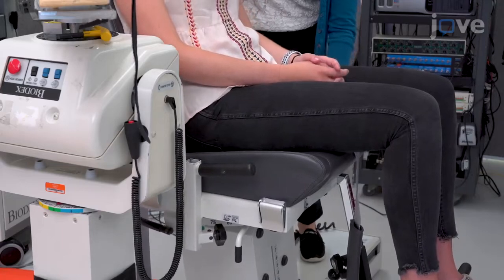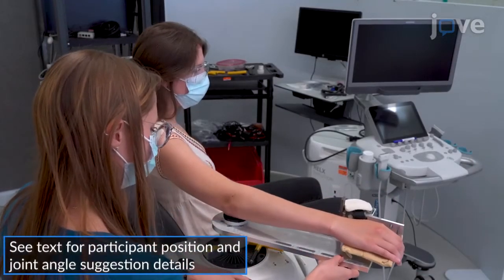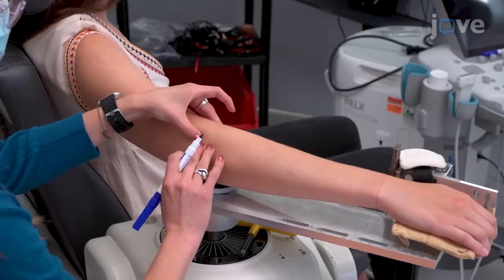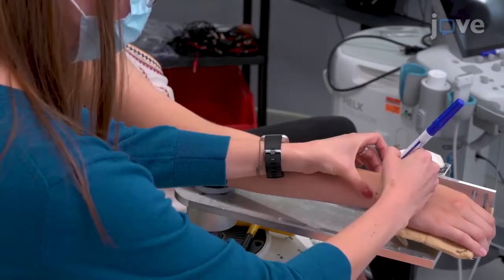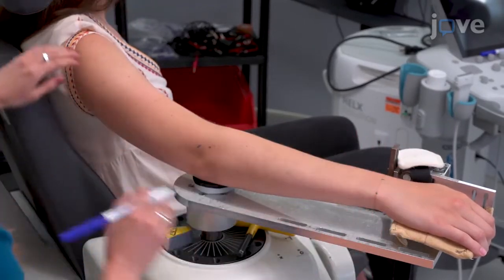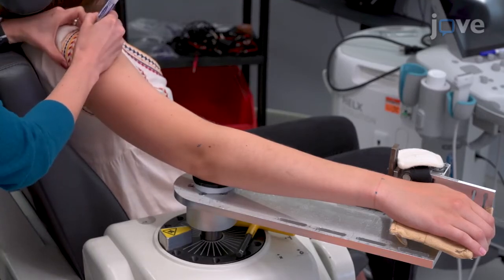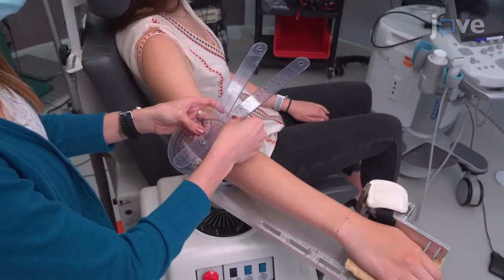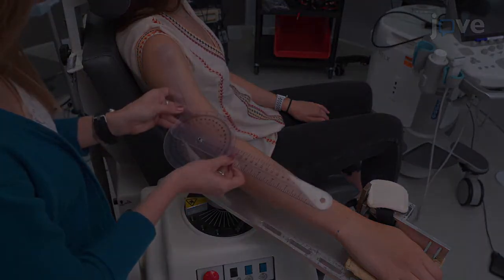muscle of interest. Place the joint that the muscle of interest spans in a posture that can be controlled and repeated, and use clinical guidance to locate anatomical landmarks. Using the ISB standards for defining the joint coordinate system, mark the anatomical landmarks with a skin-safe marker. Align the center of a handheld goniometer with the axis of rotation of the joint.